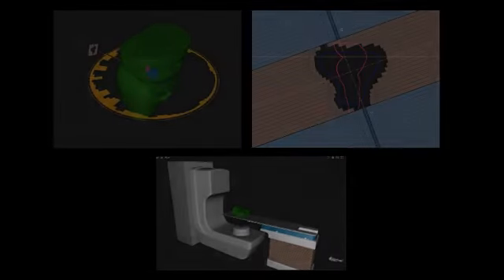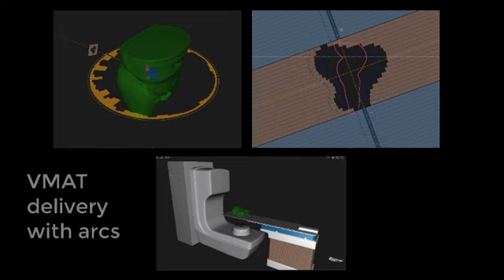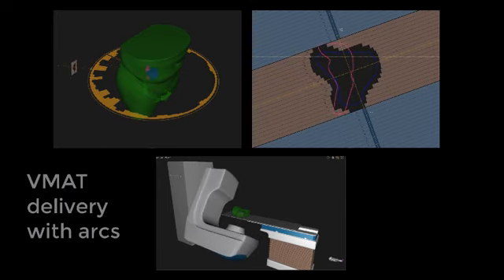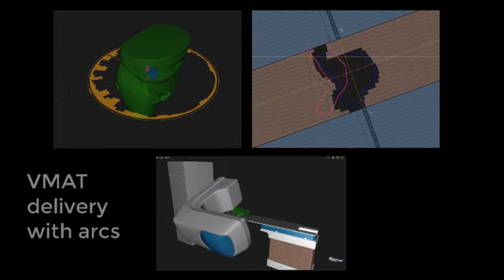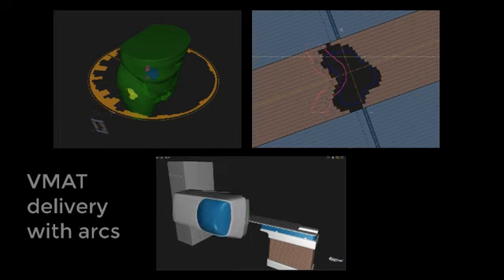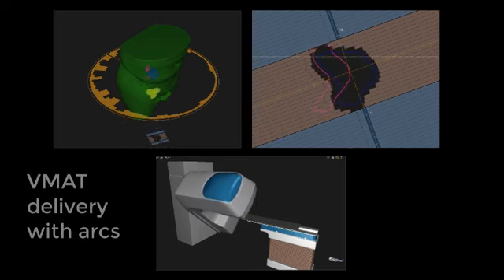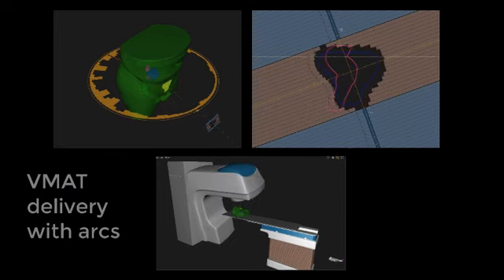VMAT is different. Okay, VMAT, as the gantry is rotating around, you're modulating the beam. The leaves are moving in a smooth fashion as it goes around the patient. And so it's a dynamic delivery, and the dose rate can change also, and the speed of the gantry, and all that together goes to modulate the dose. So it's more complex, but the idea is the same.